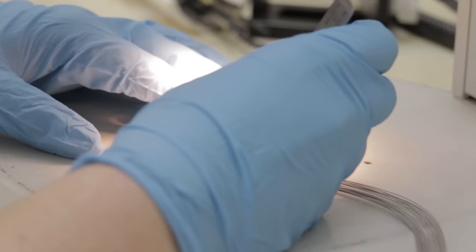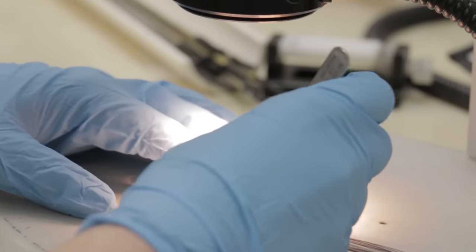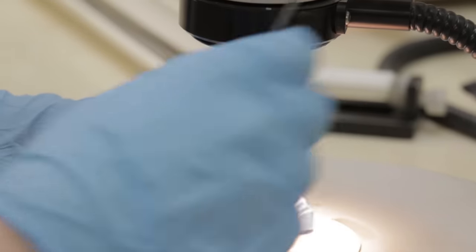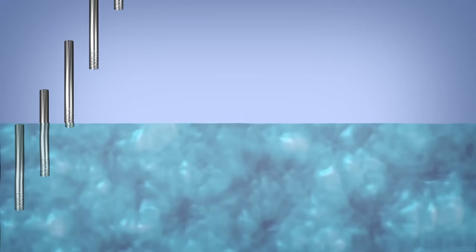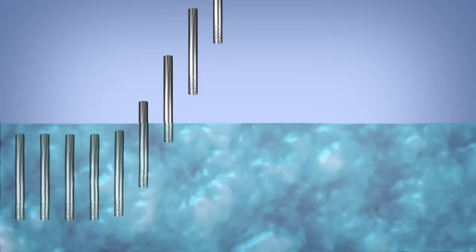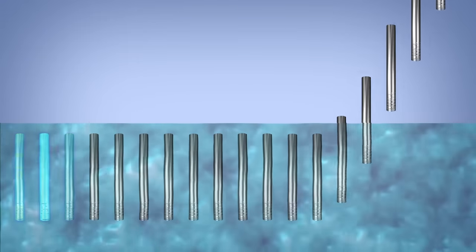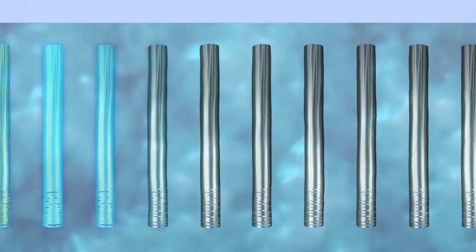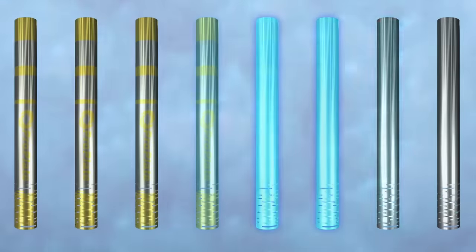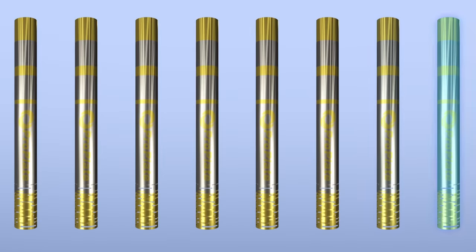Whereas traditional machined marker bands are laboriously installed by crimping individually, Visiband markers are coated and can be accomplished in high volumes simultaneously for maximum efficiency.